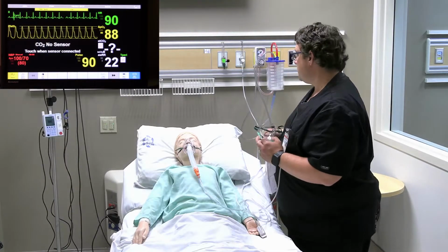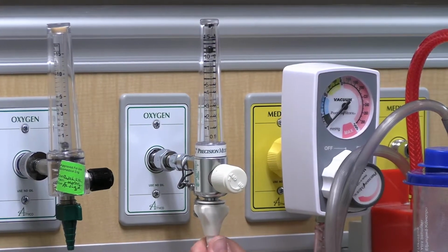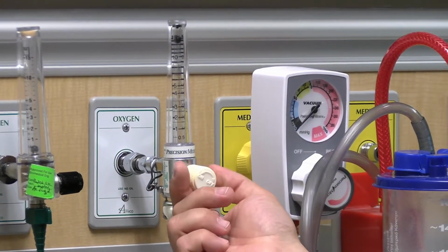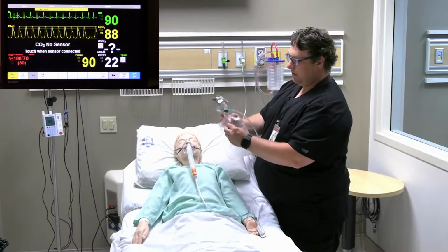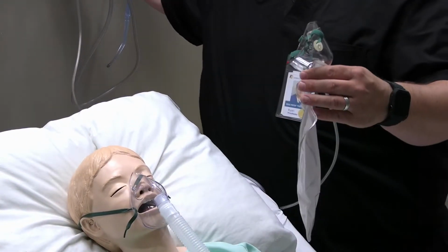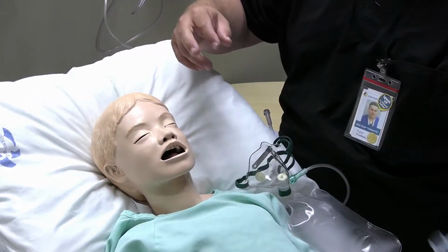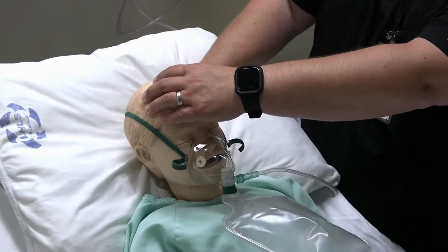And when they breathe in, they will be able to access the 100% oxygen that is accumulated in the reservoir bag. Okay, so we are going to come to our flow meter here and just remove our venti from that. I'm going to attach my non-rebreather, and I'm going to turn that up to 15 liters per minute. And then we want to see our reservoir bag inflate, hopefully. Might have to go a little bit higher. There we go. So you can see that our reservoir bag is now inflated. So we're going to come and remove the Venturi mask and apply our non-rebreather to our patient.